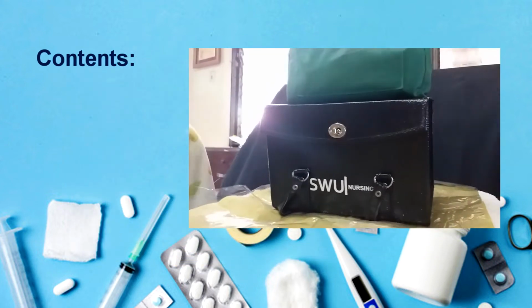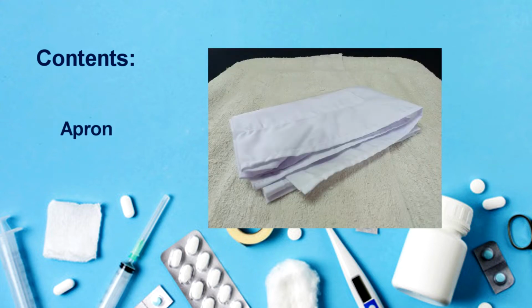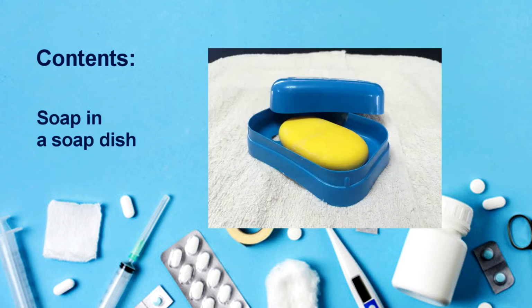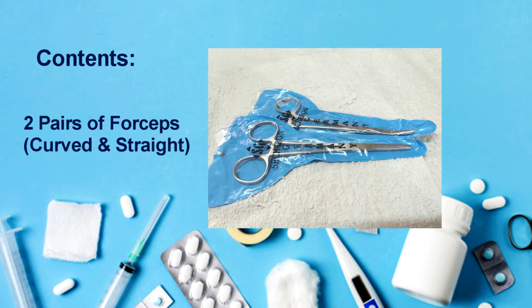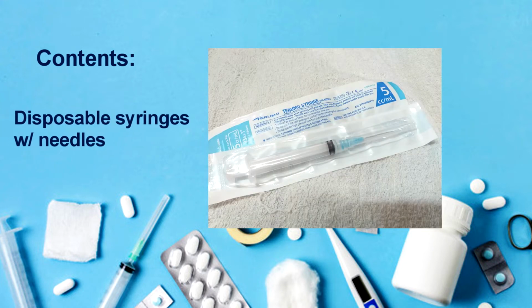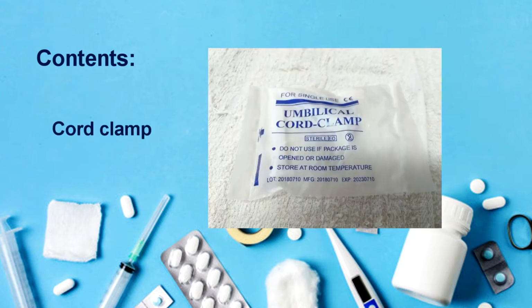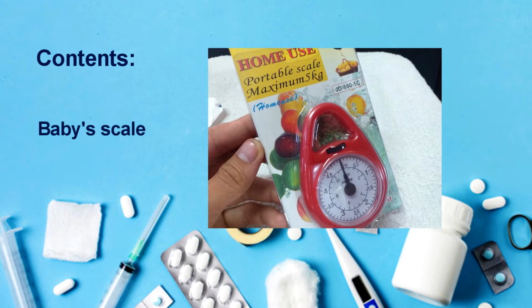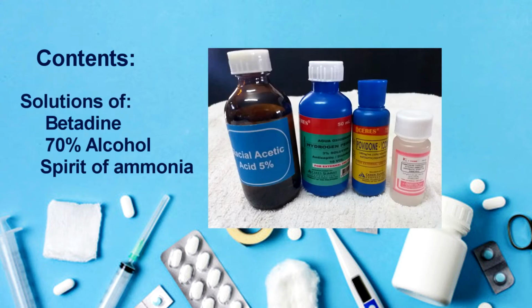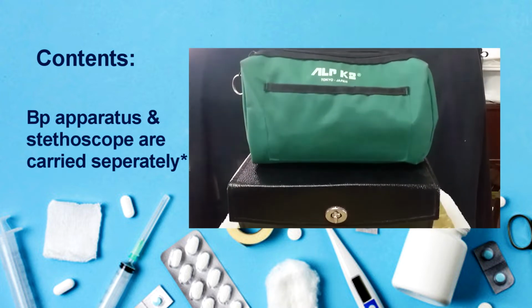The contents of a CHN bag are paper lining, extra paper for making a waste bag, plastic lining, apron, hand towel, soap in a soap dish, thermometers, 2 pairs of scissors, surgical and bandage, 2 pairs of forceps, curved and straight, disposable syringes with needles, hypodermic needles, sterile dressing, cotton balls, cord clamps, micropore plaster, tape measure, 1 pair of sterile gloves, baby scale, solutions of betadine, 70% alcohol, hydrogen peroxide, and spirit of ammonia. Note that the BP apparatus and stethoscope are carried separately and are never placed in the bag.